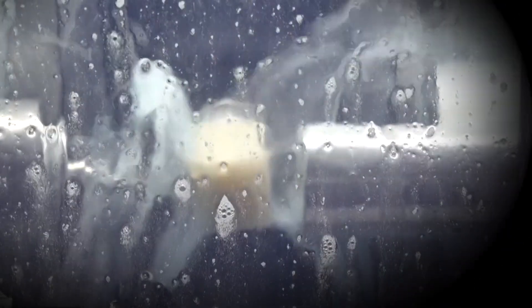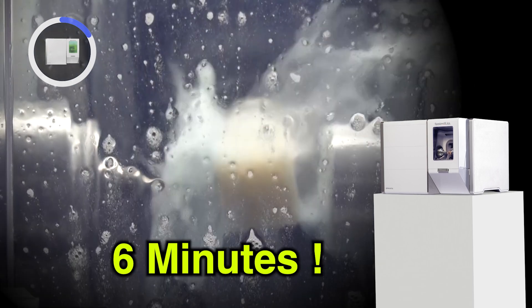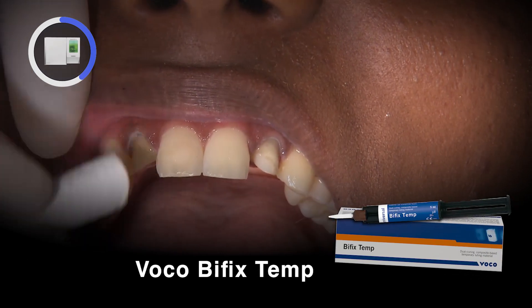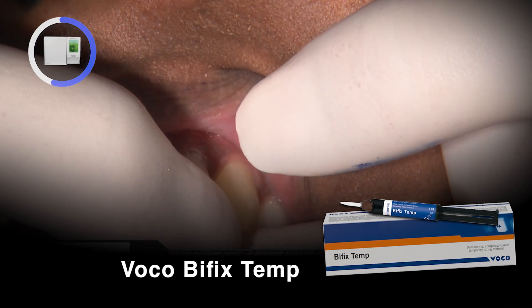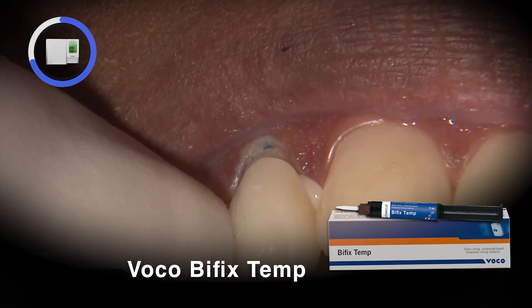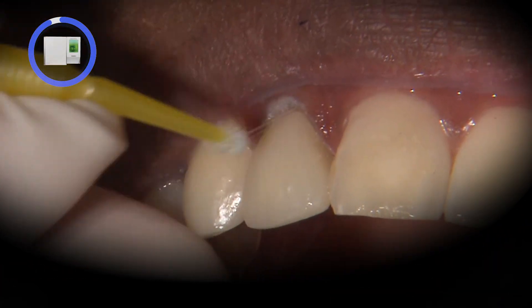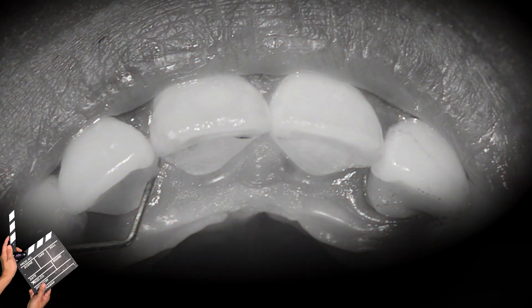The designs are then transferred to the Fast Mill where it'll take 6 minutes to make a perfect fitting provisional out of the BioTemps Now blocks. Once each sprue connection has been removed, we use Voco Bifix Temp, which is a very strong and easy to use composite-based temporary cement. Since these restorations fit so well and the margins are so precise, it certainly offers peace of mind during this temporary phase while we wait for the final restorations to be fabricated.